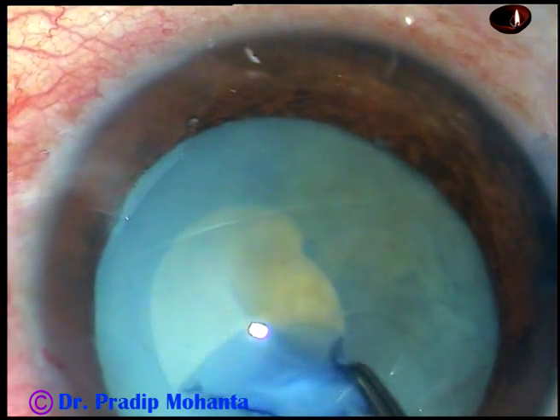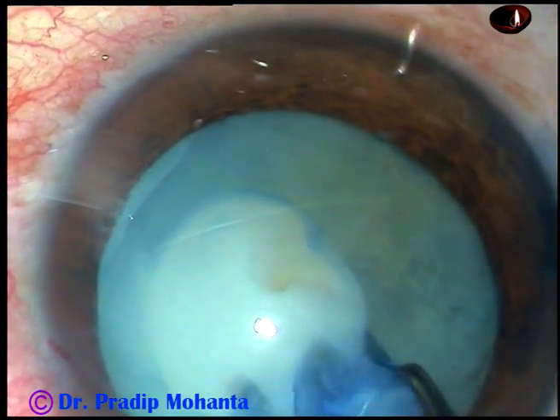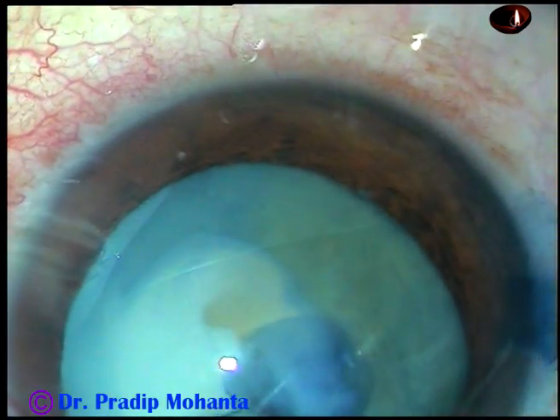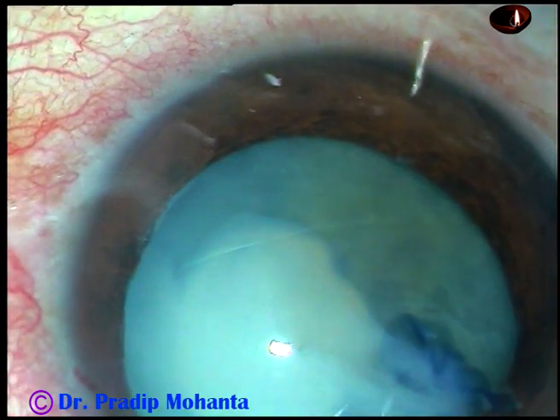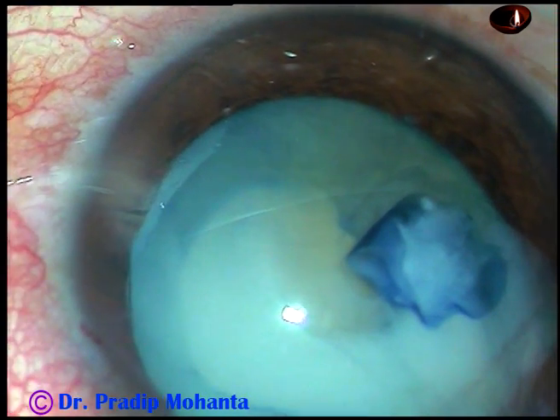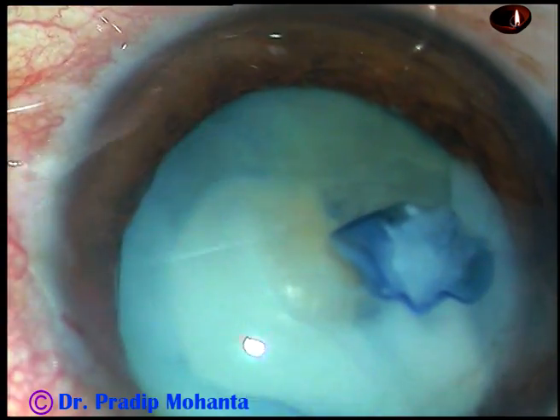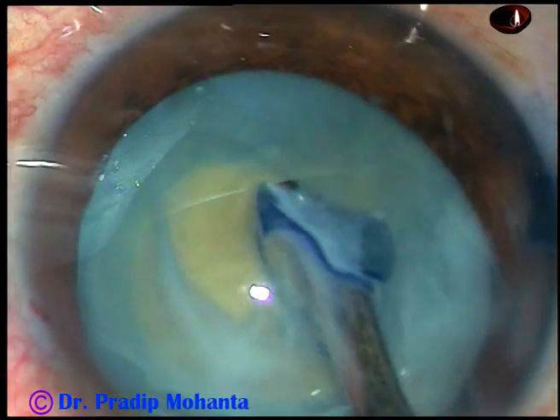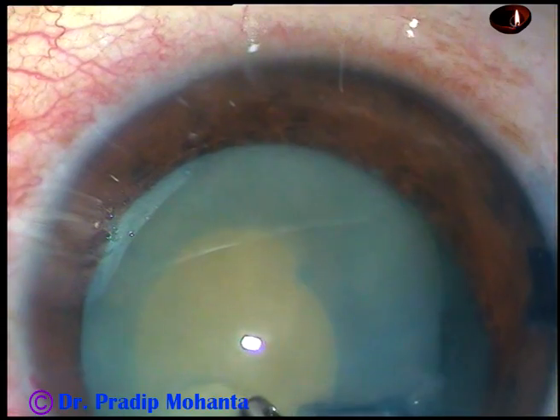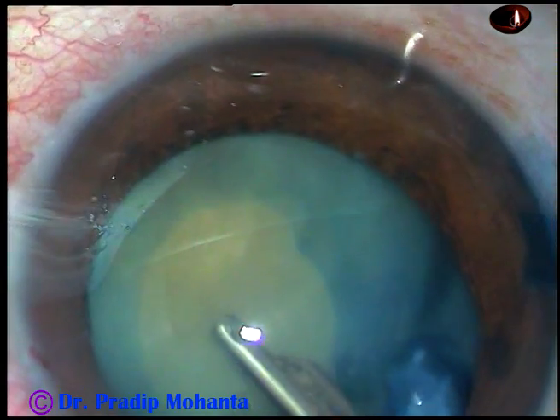As I come near 12 o'clock, a lot of milky fluid comes out from the capsular bag and it obscures visibility. So I stop here and ask for a 23-gauge Simcoe. I want to wash this milky fluid out. As I wash the milky fluid, you can see the free-floating nucleus.